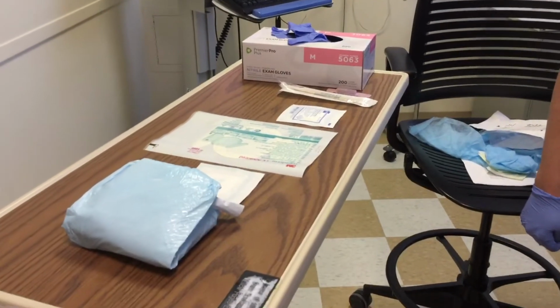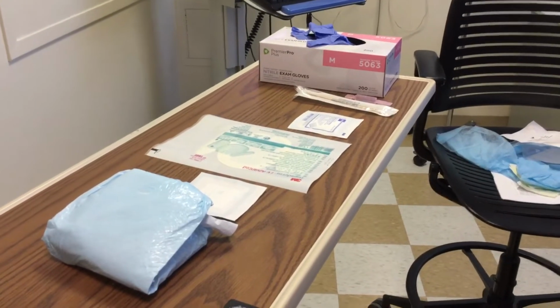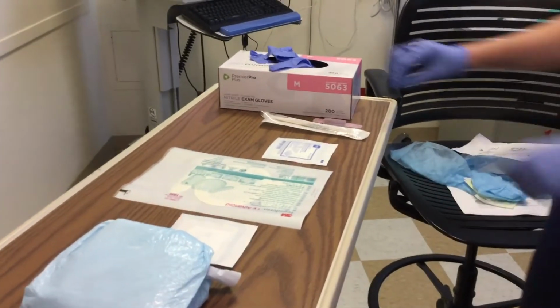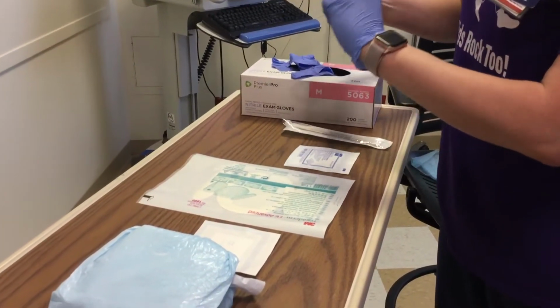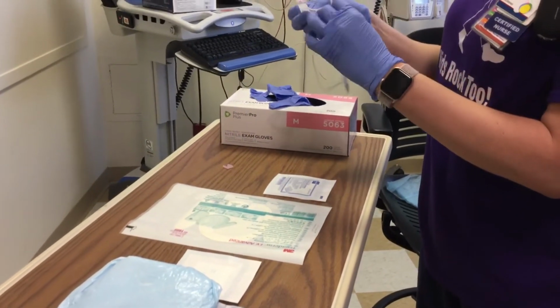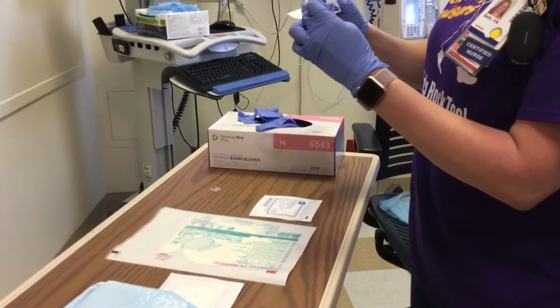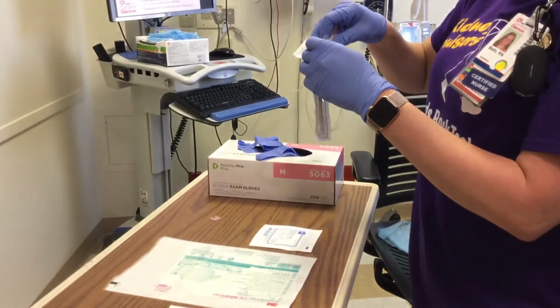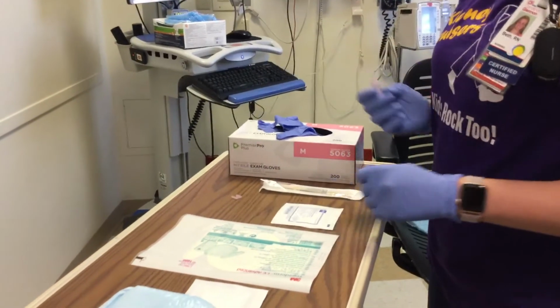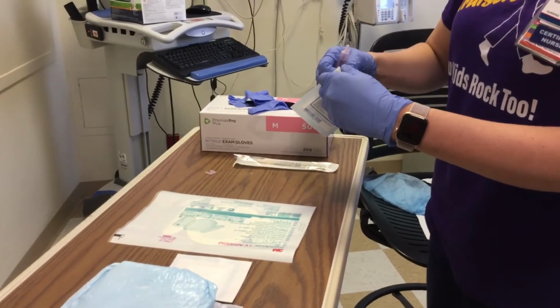Then off to the side, open your cotton applicator tips and you're going to squirt the saline inside so that way the tips are moistened. And next you will open up your gauze and moisten the gauze.